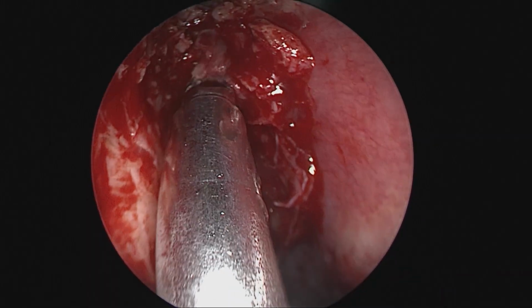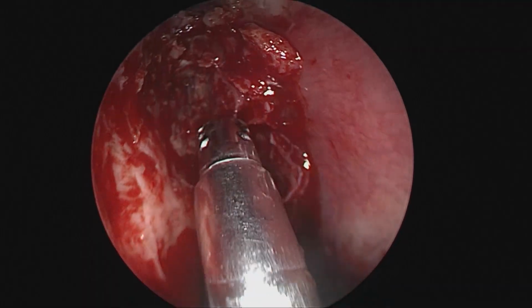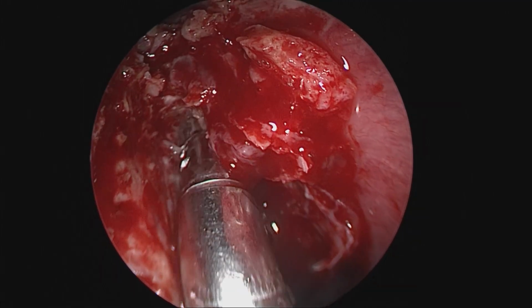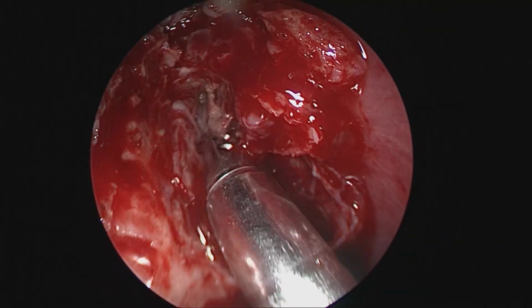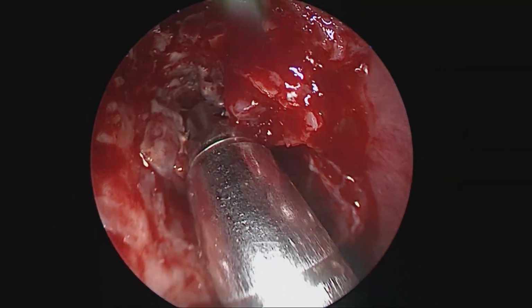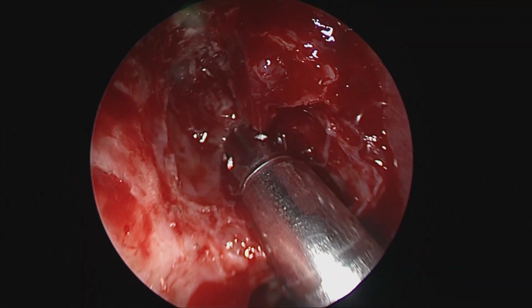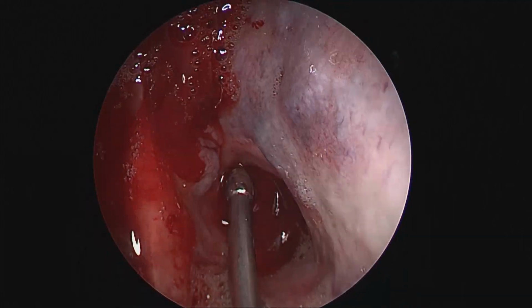Now what we are doing is just using the microdebrider on the posterior most aspect of the attachment of this tissue. At some places, it may not be possible to even analyze if the posterior most tissue is actually the papilloma, or it is just scar tissue or polyp tissue. But for whatever it's worth, it's best to assume all this is diseased and to completely remove it and not leave anything behind. You can also see some purulence in the posterior ethmoid cavity, which again has to be cleared.